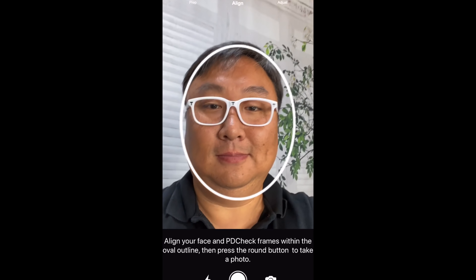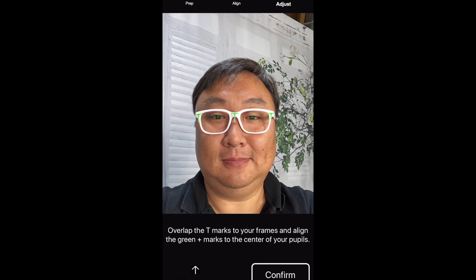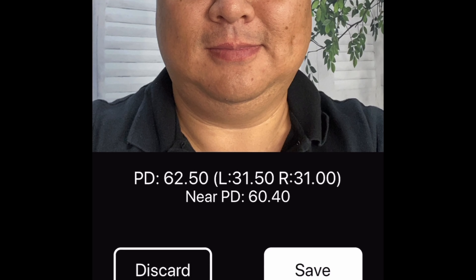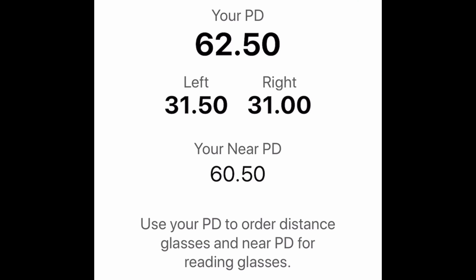You mark where your pupils are and take a picture of yourself. The app will identify where these T's are as well as your pupils. You can do some adjustments within the app to make sure everything lines up, and the output is the exact pupillary distance you need, because you want to make sure those lenses are placed correctly into the frames you order.